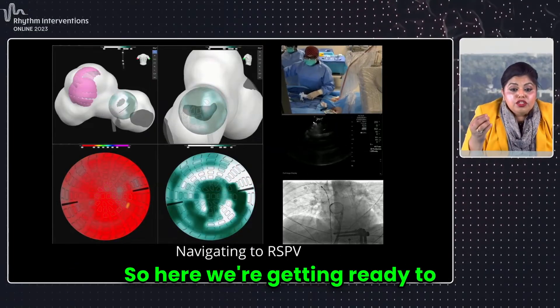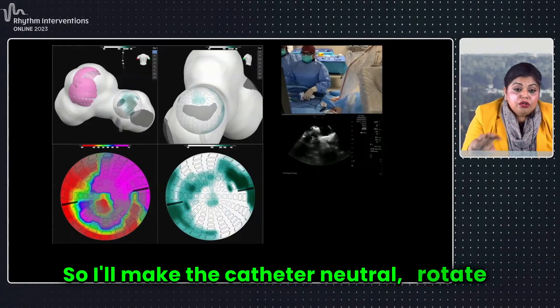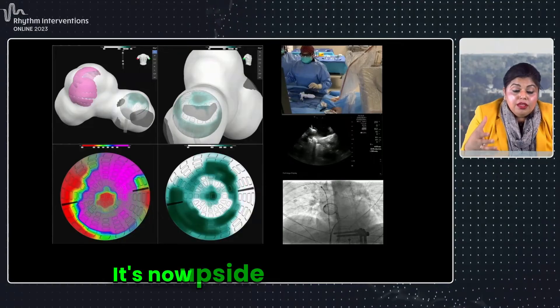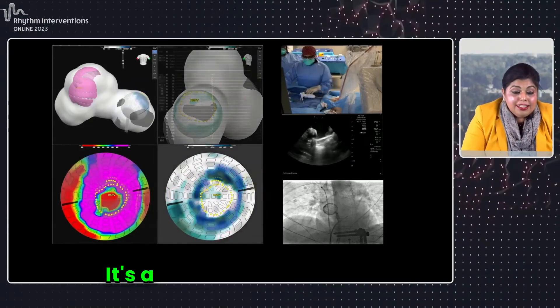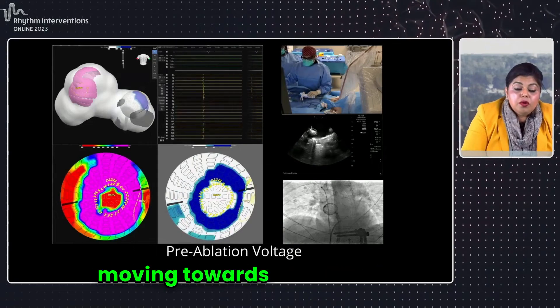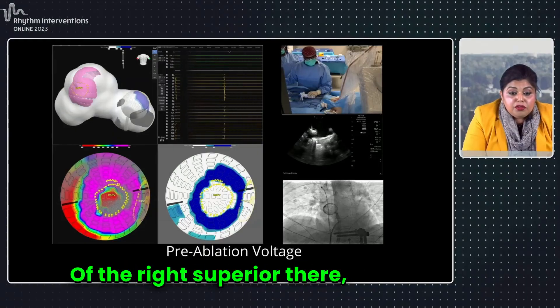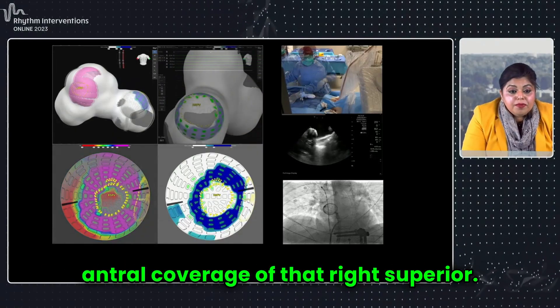Here we're getting ready to navigate into the right side. I'll make the catheter neutral and rotate it. You can see my delivery handle on the camera — it's now upside down, which tells me I've turned that way. I'm using my deflection; it's a bidirectional deflection, moving towards the right superior. There is a beautiful contact map of the right superior showing nice antral coverage of that right superior pulmonary vein.